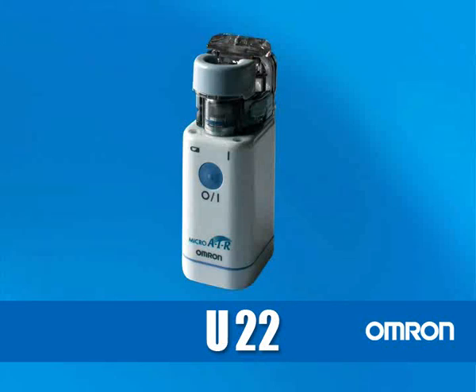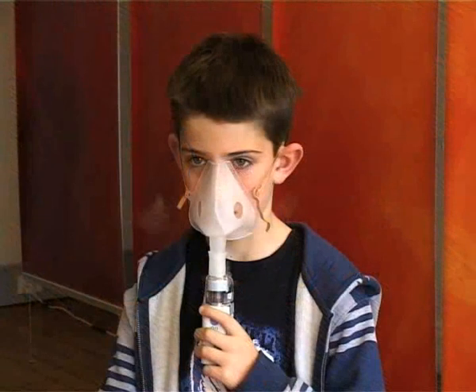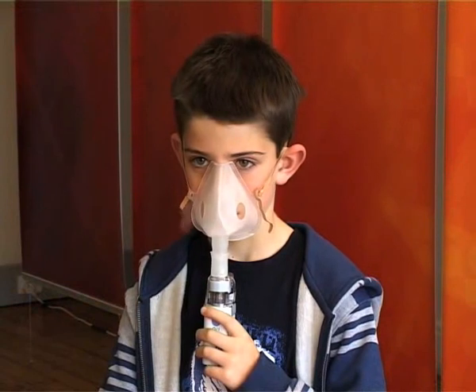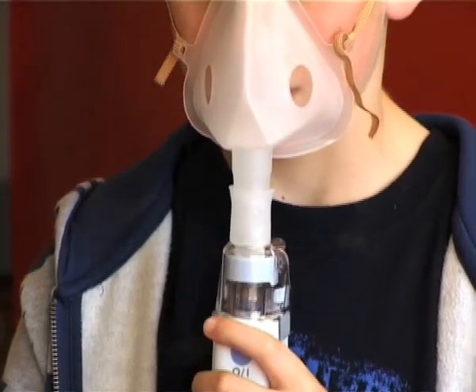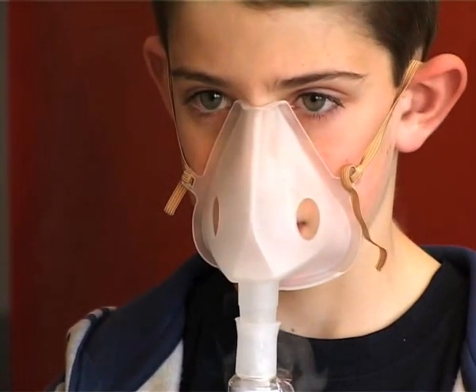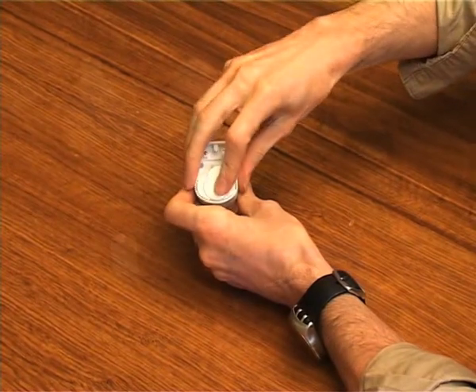Omron NEU22 Mesh Nebuliser. This nebuliser is a revolutionary product from Omron, improving nebulisation efficiency, providing inhalation of medication at all angles, and offering a truly portable option by using twin AA size batteries as a power source.